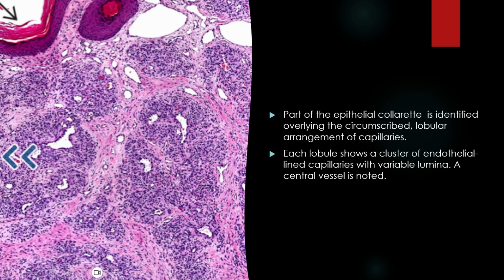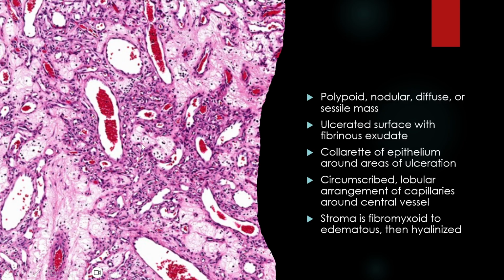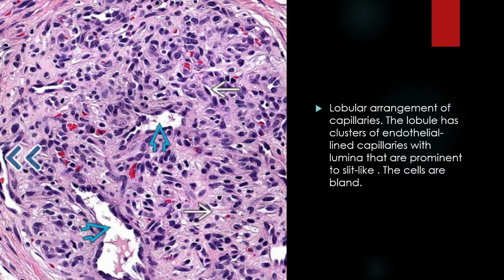Just want to show you this lobular structure, big vessel feeding by small vessel forming this lobular structure, really characteristic. And then in the stroma you can see different kinds of mixed inflammatory cells, like lymphocytes, maybe plasma cells, eosinophils, neutrophils, but kind of mixed.